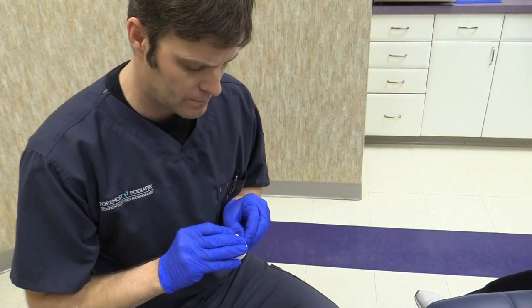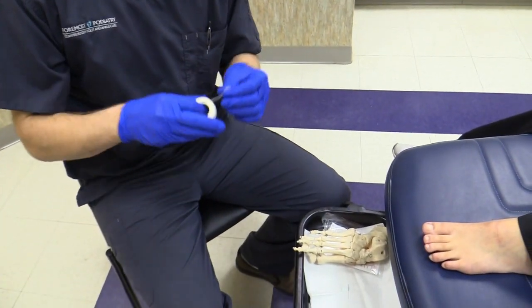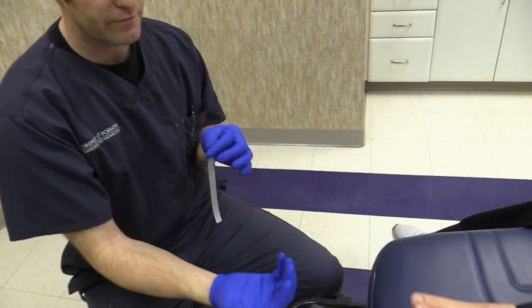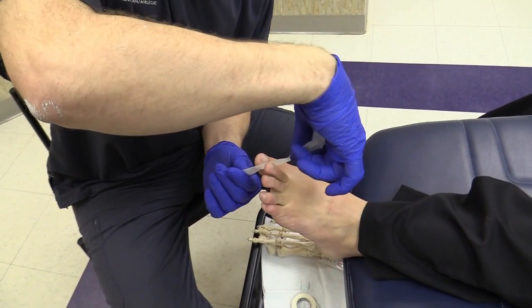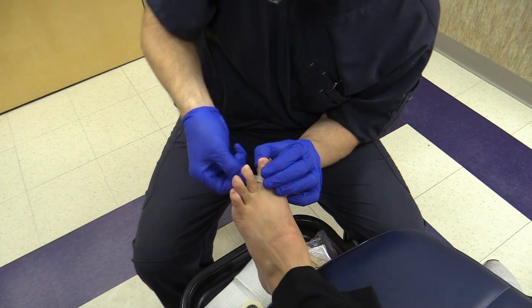The first thing you're going to do is get about a six-inch piece of tape. Go ahead and put the foot out here. The trickiest part is wrapping it around the toe — you're going to take it and wrap it around the base of the toe, like so.